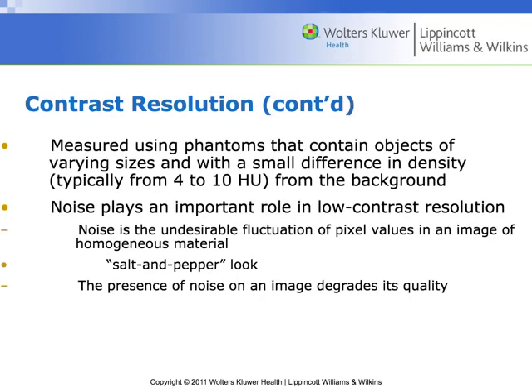Because it's a continuous function, it's going to uniformly distribute noise across the entire set, right? But through iterative reconstruction, through new reconstruction algorithms, we can say, no, the noise is only right there. Get rid of it on everything else. Don't sample it as a continuous function. So we'll look more at that. But in general, what we're going to see is fluctuation in pixel values. It'll give it a grainy or a salt and pepper appearance. Okay?